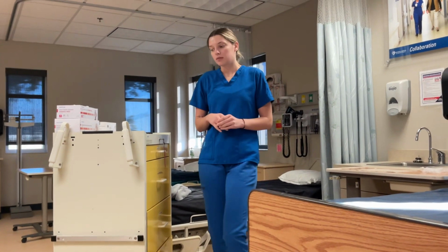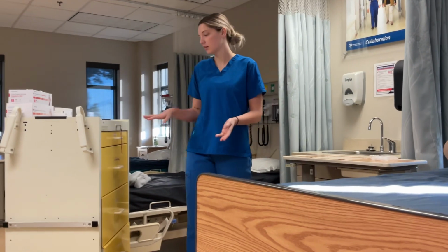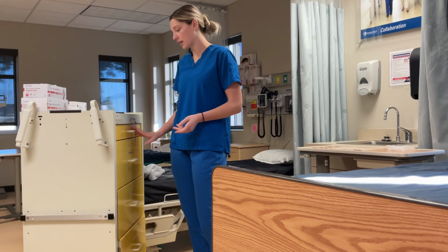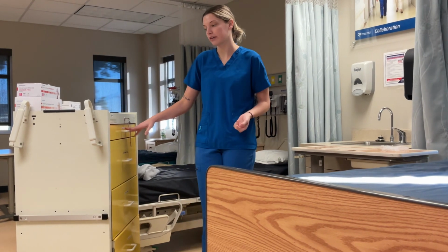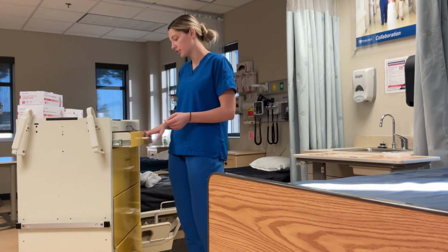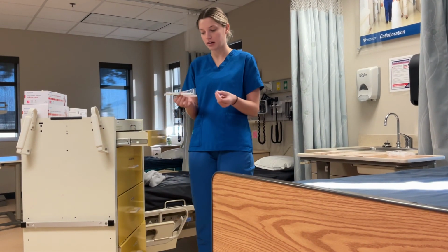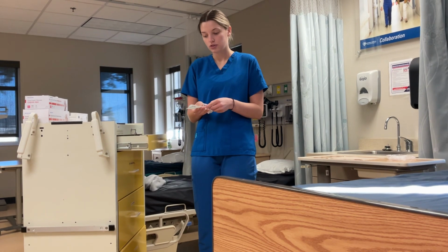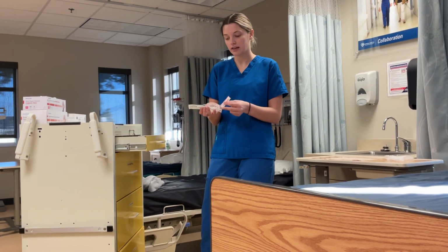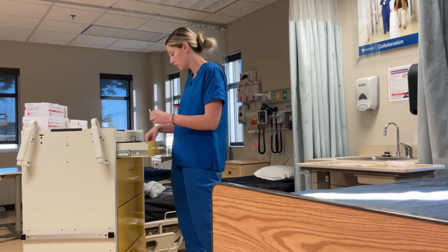And then I would gather my necessary equipment. So my medication is in my drawer for when I get it out for the first med check. I would make sure my packaging for my tools are intact, and today they are open just for practicing purposes.